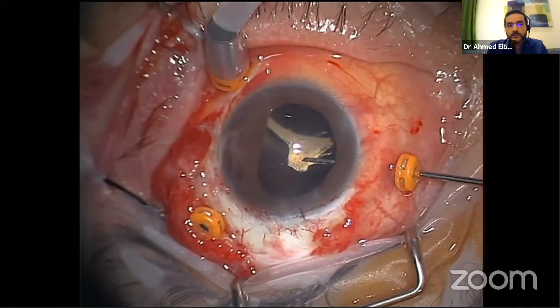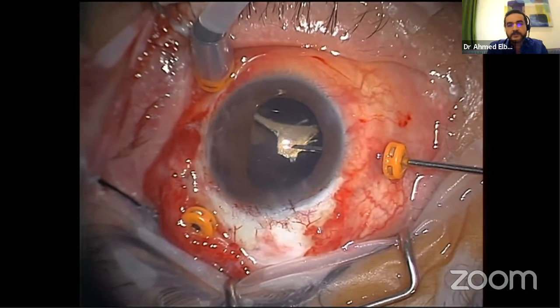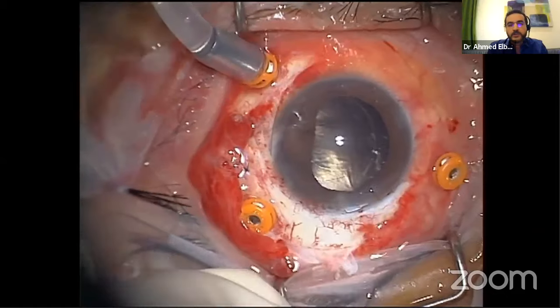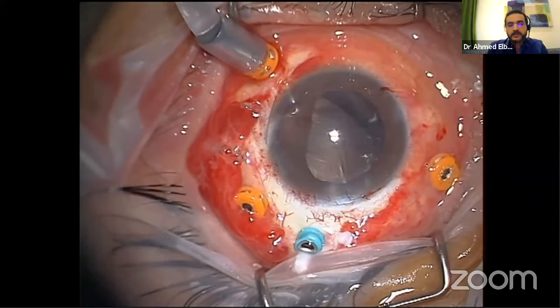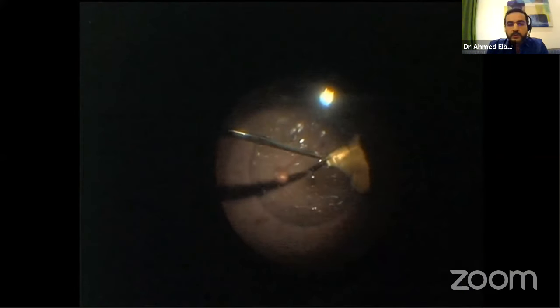So what I'm trying to do now, I cannot deliver it in this way, so I have to put it back after putting perfluorocarbon and then use chandelier lights, because I want to hold it in a way that allows me to deliver it safely with the curvature matching the corneal curvature. So while delivering to the anterior chamber, it will go smoothly without injuring the endothelium of the cornea.